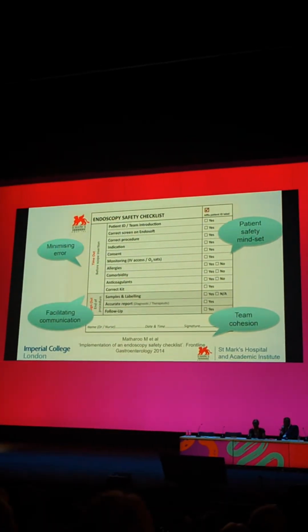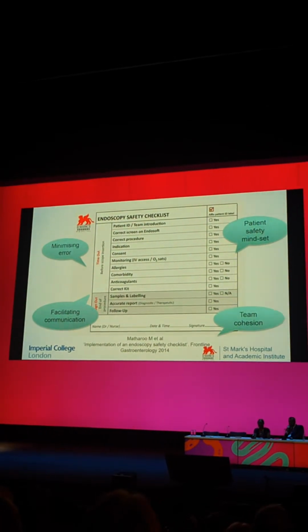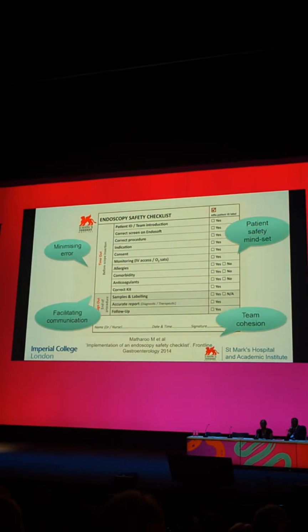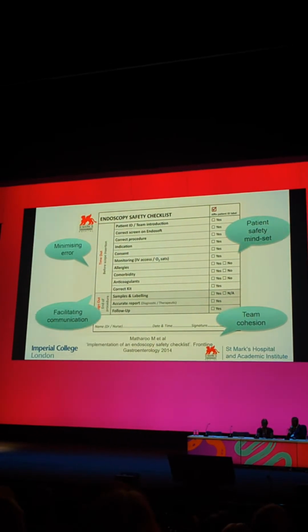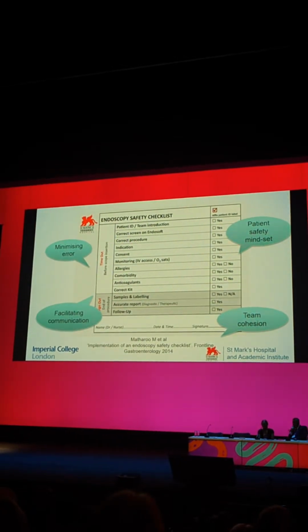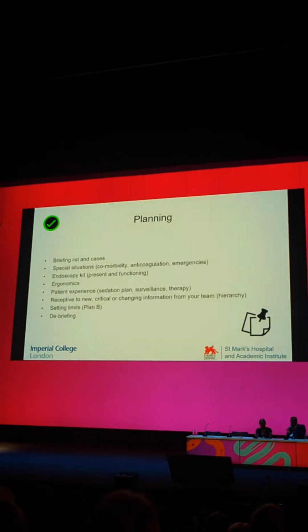And this obviously leads very nicely into the checklist, which is another safety tool at the last moment before the scope is inserted. I think this is now widely used, but actually this is a relatively new intervention in our safety approach to endoscopy. The briefing helps the safety checklist so that you get to the point where the patients come in appropriately prepared.